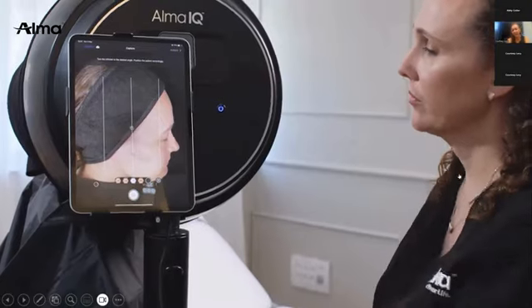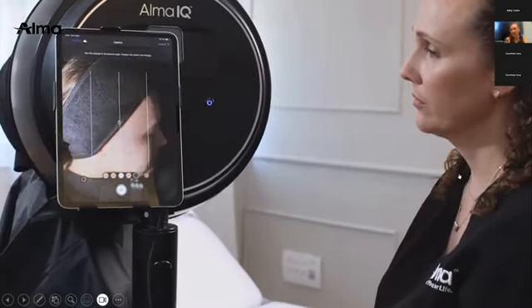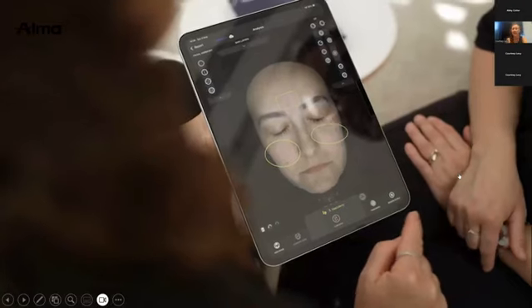This is for 90-degree capture, less used on a day-to-day basis. I would say it's only really necessary if the patient has some sort of indication really on the side of their face that you need to capture. Generally, the center and the right 40 and left 40 is sufficient.